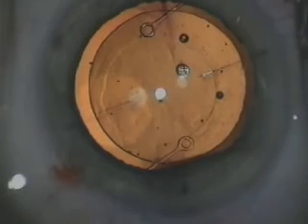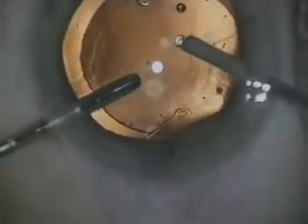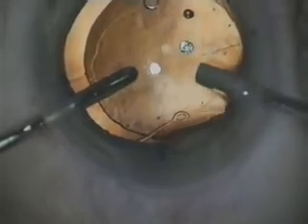After rotating the lens and ensuring a precise alignment of the intraocular lens marking with the steepest corneal axis markings, the viscoelastic solution should be thoroughly and completely removed. In the unlikely event of lens rotation during the removal of the viscoelastic solution, a repositioning can be performed during irrigation.